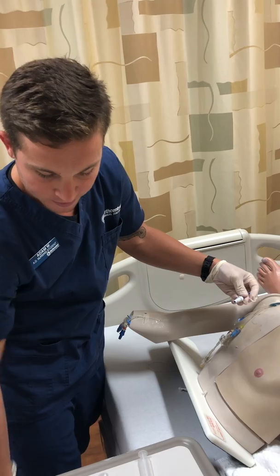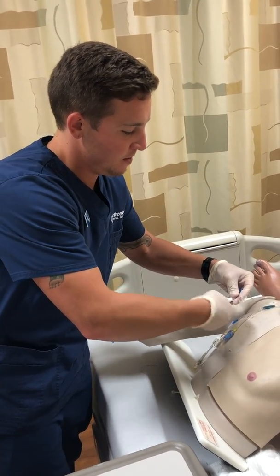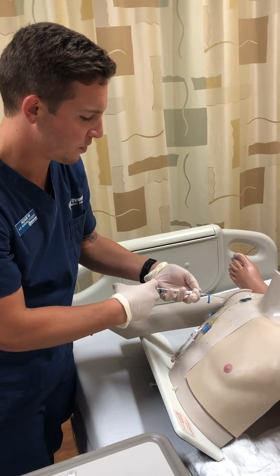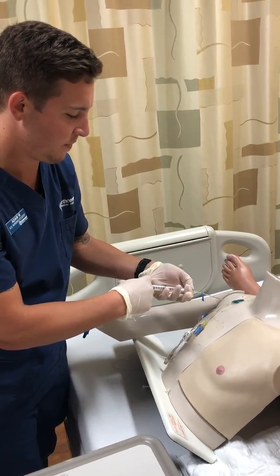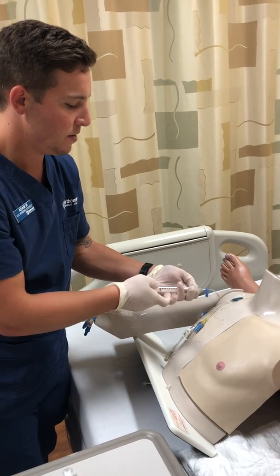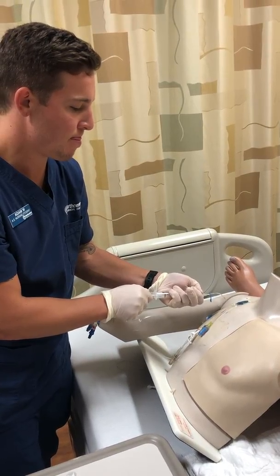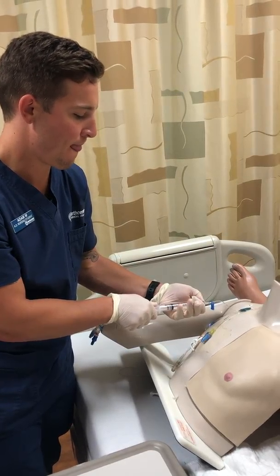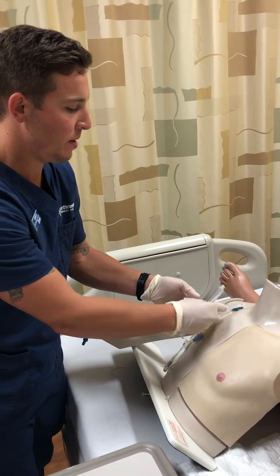Okay. Attach our first normal saline flush here. So what we're going to do with the first one, nice and slow. Okay, after we have all 10 in, we're going to aspirate the 10 mils back out, okay? So, okay, we're going to remove, reclamp.